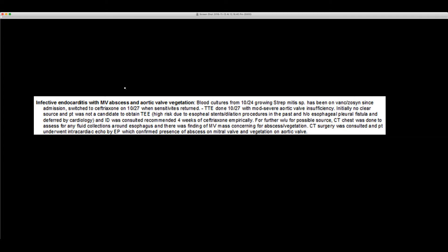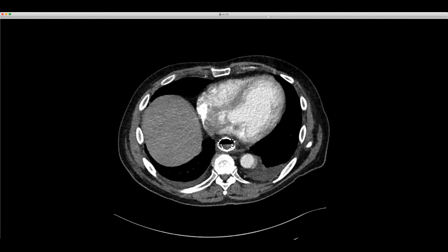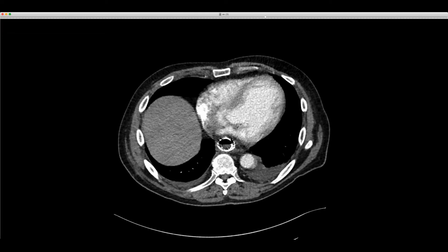Because it was important to find a source, they went ahead and did intracardiac echo, and found that there was indeed a mitral valve abscess. They also found an aortic valve vegetation that I had not seen. The prior echo had shown some mitral and aortic insufficiency. They finally confirmed the mitral valve vegetation that we suspected on the chest CT — a nice case of how you really need to look hard along the valves in suspected endocarditis.